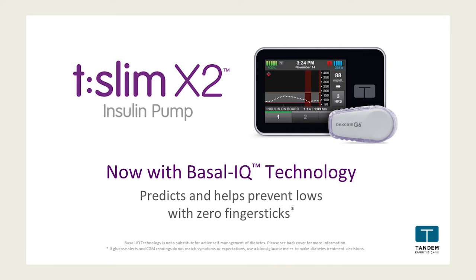Where that can be really fascinating, I had a patient come see me. Her basal rate is set at 23.5 units per day. She's on this nice system and she's excellently controlled, and we see that it's stopping her so that on average she's getting 20 units of basal per day. So what it allows us to do is go back and say, well, why leave it at 24 and rely on the system? Let's just move it back to what you get every day anyway. So we moved it back to 20 and we reduced the number of times that it had to suspend to prevent a low blood sugar.